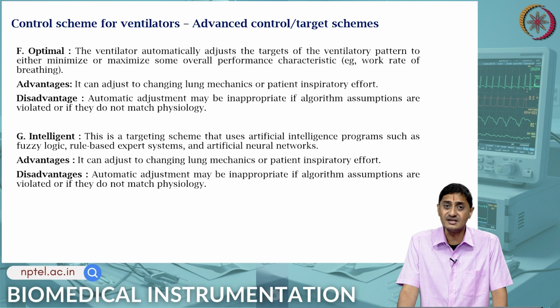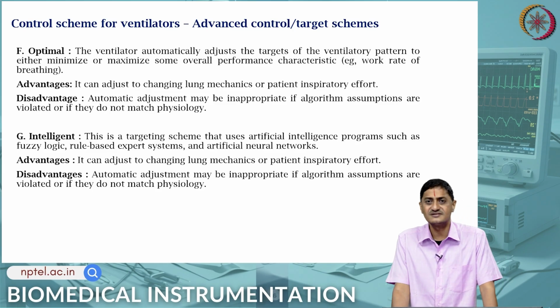And the good thing is that it can adjust depending on the patient situation, patient condition, lung mechanics or inspiratory effort. The disadvantage is that it may not be very appropriate if the algorithm assumptions are wrong, like they said in the previous case. Right.